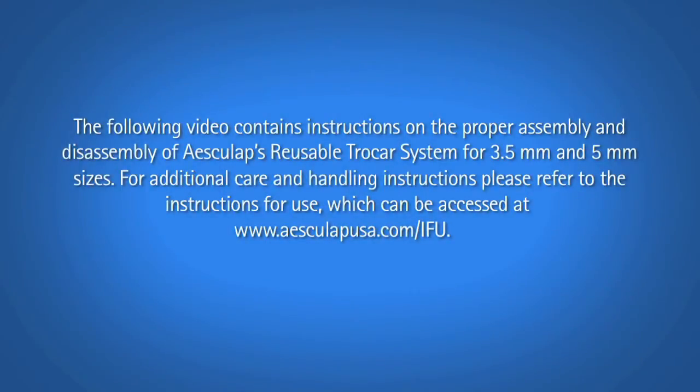The following video contains instructions on the proper assembly and disassembly of Esculap's reusable trocar system for 3.5 millimeter and 5 millimeter sizes. For additional care and handling instructions, please refer to the instructions for use, which can be accessed at www.esculapusa.com/ifu.